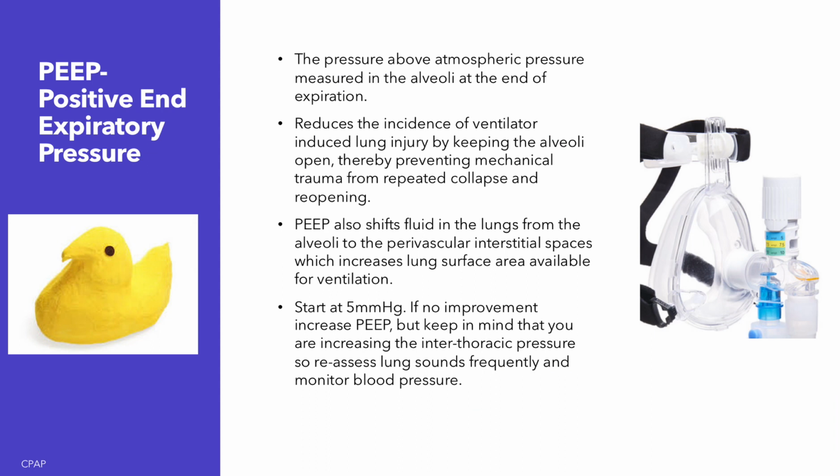A little PEEP review. As we said before, it's the pressure above atmospheric pressure measured in the alveoli at the end of expiration. It reduces the incidence of ventilator-induced lung injury by keeping the alveoli open, thereby preventing mechanical trauma from repeated collapse and reopening.